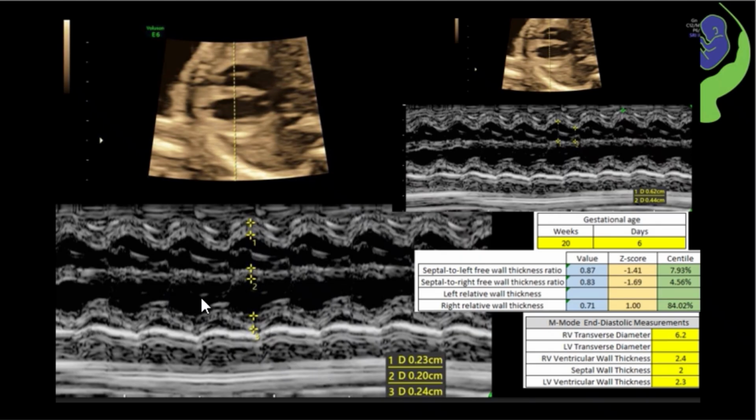Suppose you find any echogenic clutter on M mode here, in this area or this area. One important trick to avoid that is to increase the contrast and decrease the gain so that you will cut out any interference from the papillary muscle motion. So to avoid echogenic clutter, as I said, increase the contrast and decrease the gain.